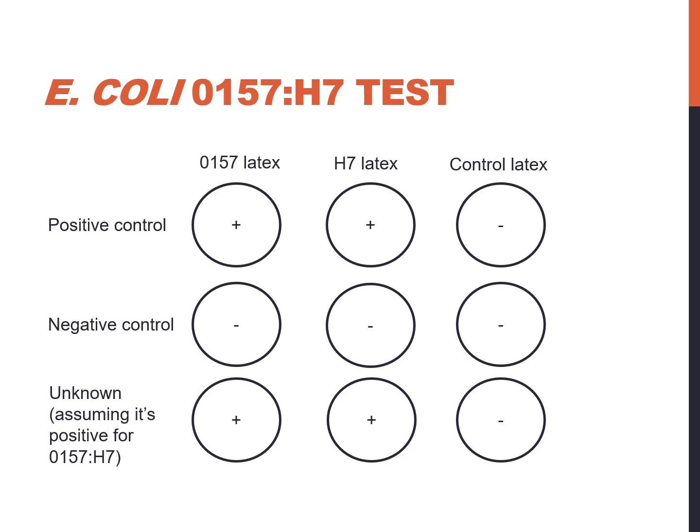So that concludes Unit 18, where we discussed our miscellaneous gastrointestinal pathogens and methods for identifying certain things like Yersinia enterocolitica, Vibrio cholerae, Vibrio parahaemolyticus, and other organisms such as Clostridioides difficile, Campylobacter, Aeromonas, and a little bit about serotyping Salmonellas and Shigellas. So stay tuned for Unit 19.